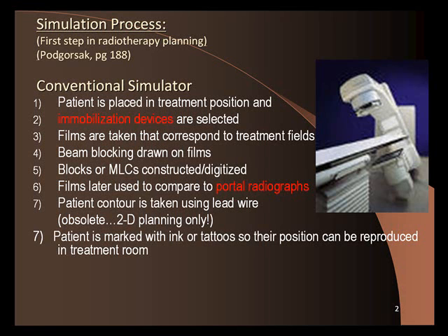This is a bit of a history lesson. By the time you guys get out in the field, you won't have too many of these around, but this is just a little background. So they take the simulator films, and on the films, the doctor takes a pen and draws what they want to block. So in this case, the doctor might want to block this, and this, here.